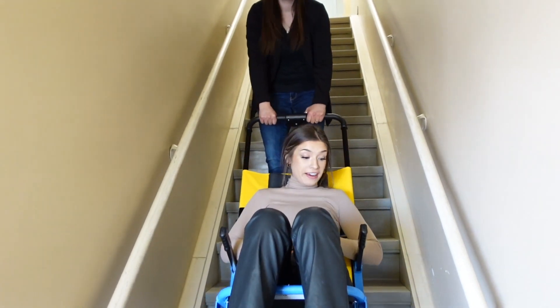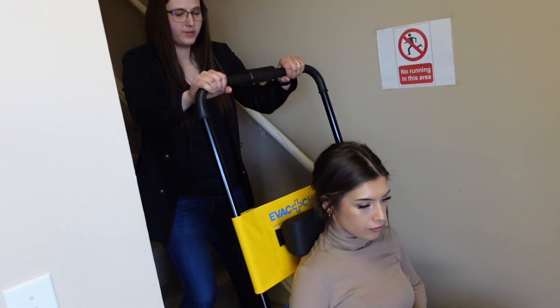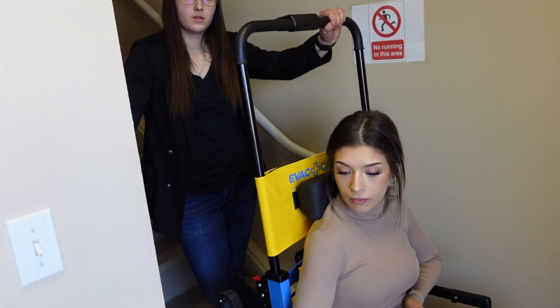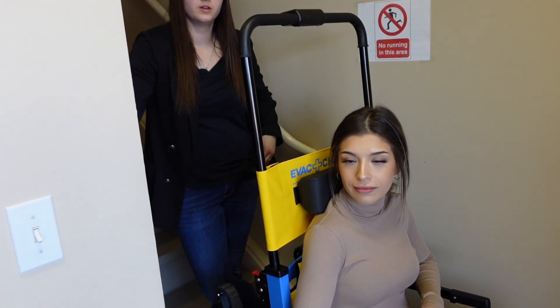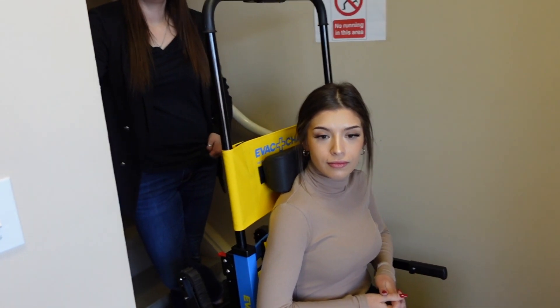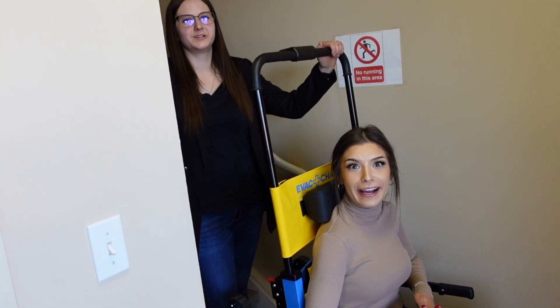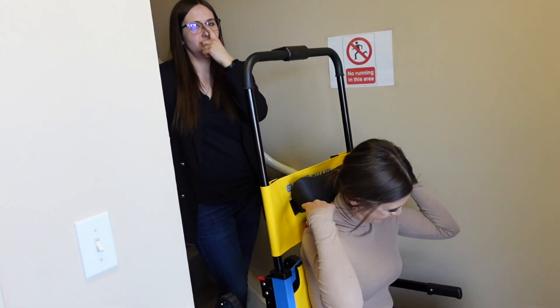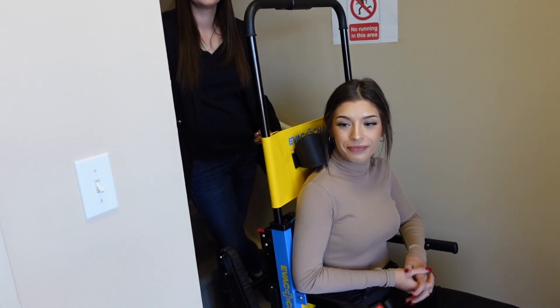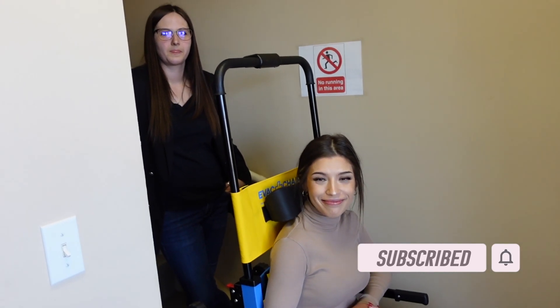This is a really nice solution for getting people out of homes or buildings. You could even use it at a home - if you have a guest visiting once in a while and you want to take them upstairs, this is a nice solution. It's also great for schools, apartment buildings, and churches. This is the EVAC chair 800 - it weighs 66 pounds and has a 350 pound weight capacity, which covers a pretty good range of clients. Thanks to Kim for volunteering, and we'll see you guys again - take care from Bills and Cass.